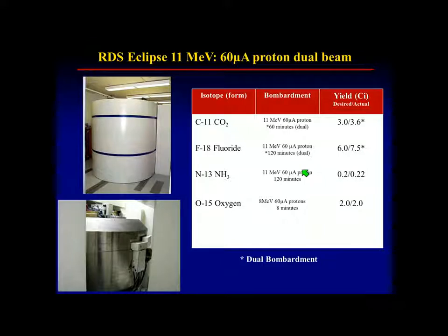So again, if we need to work on the machines to replace or rebuild targets, we have to break the vacuum. And once we finish working, we have to pull the vacuum down, and depending on the machine, it can take a significant amount of time.